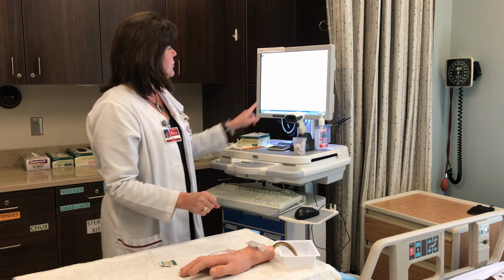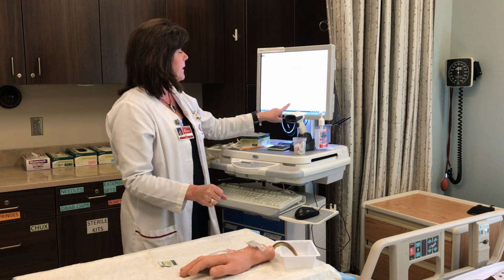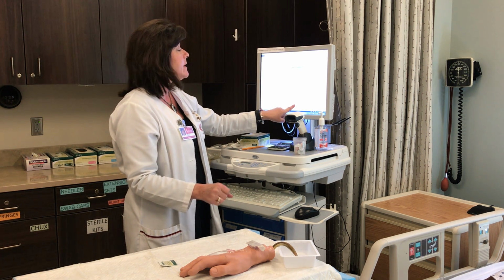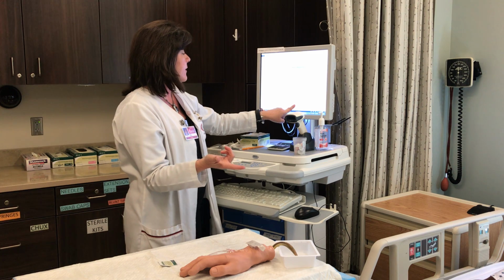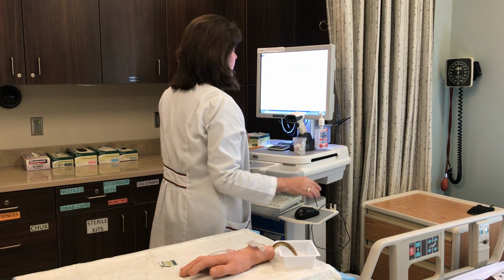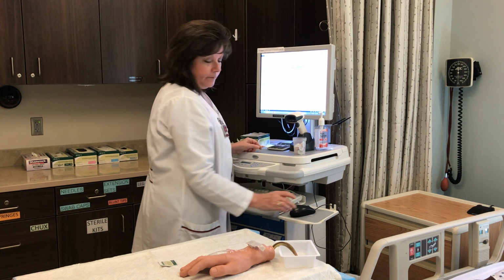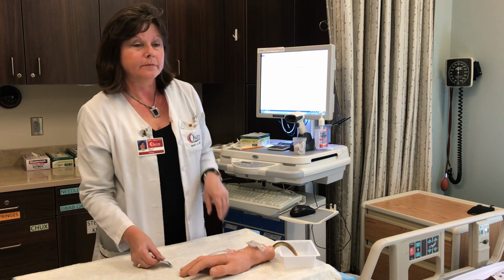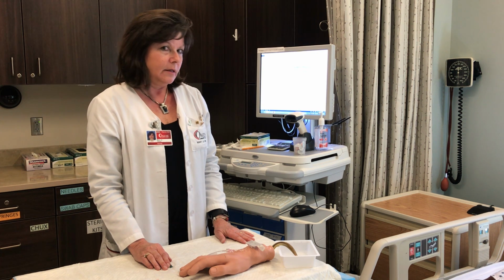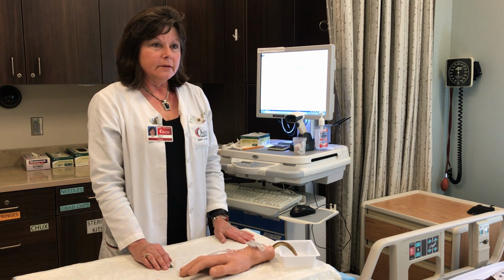I'm documenting 2 of the saline on my 0.9 sodium chloride 2.5 ml IV push, since I did use 2 of those syringes. I put the time and my initials and strike through both. At the end of the procedure, the instructor will note that the student maintained proper body mechanics, maintained patient safety, and maintained sterility during and throughout the procedure.